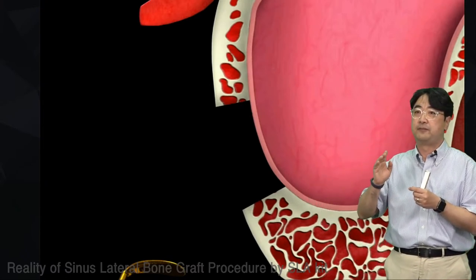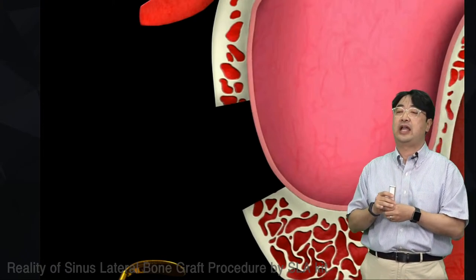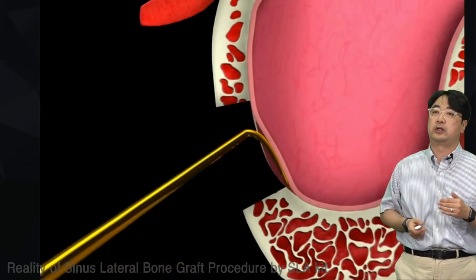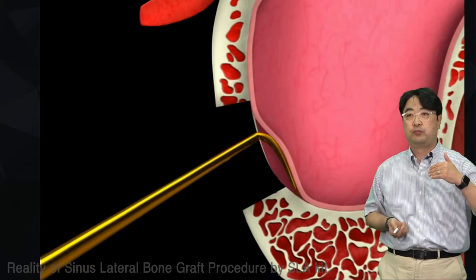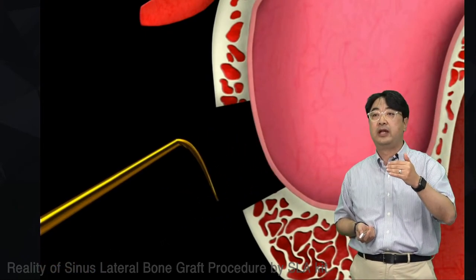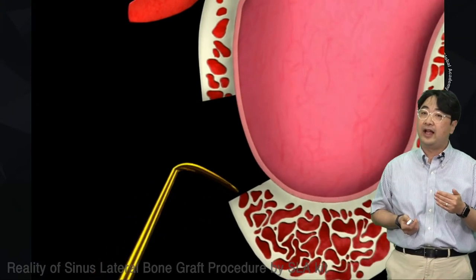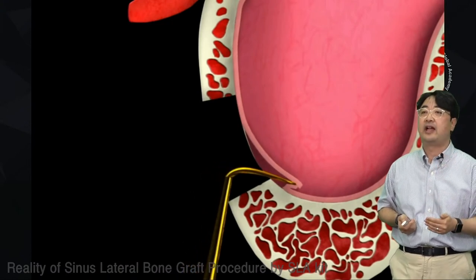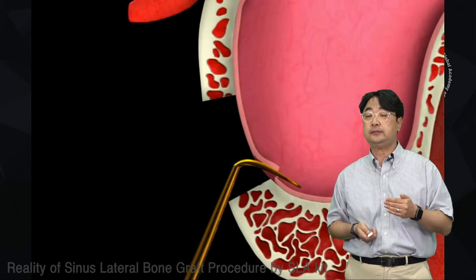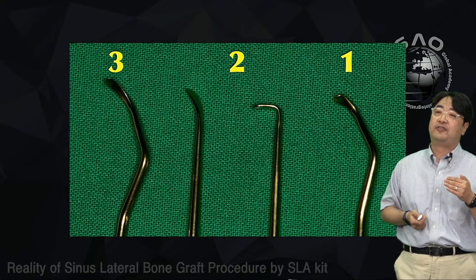But when you push out, the end of the tip of this instrument has to touch the bone. Okay? So this is how it works. With the freer elevator, you push out, and the end of the tip has to touch the bone itself. If not, you may have a tear during the dissection using the freer elevator. In the SLA kit, there are three freer elevators.